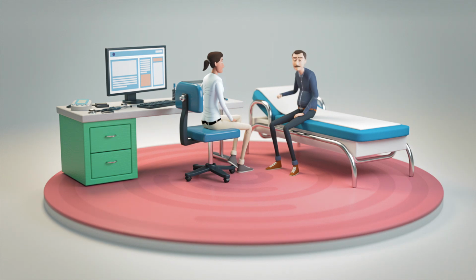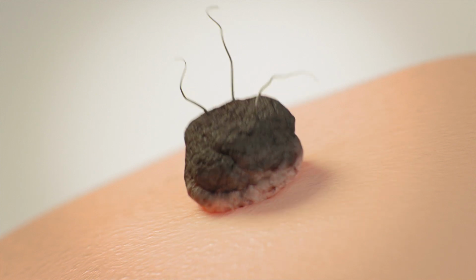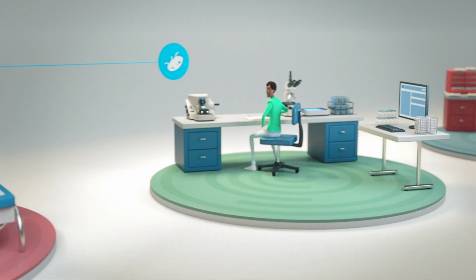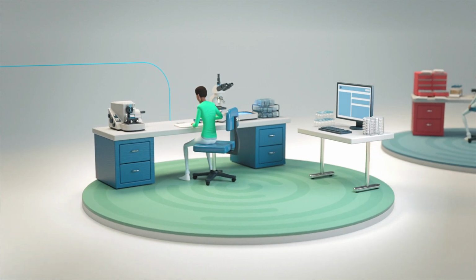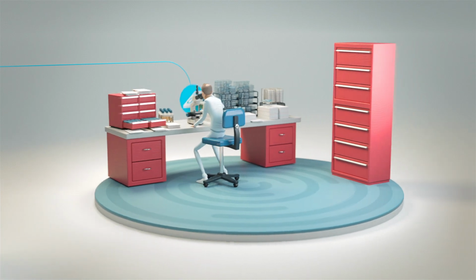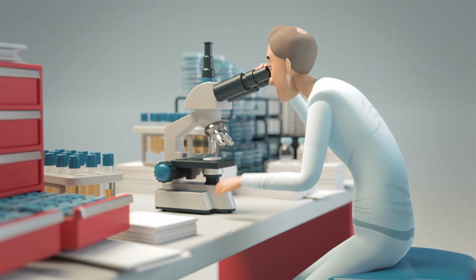This is Steinar. He has a suspicious mole. Steinar's mole is therefore removed and sent to the pathology lab, where a bioengineer prepares a sample of the tissue for microscopy. This sample is passed on to the pathologist, a specialist in cell and tissue diagnostics.